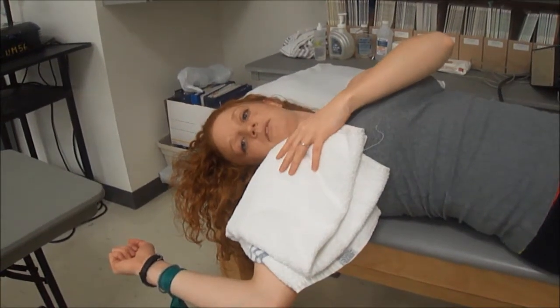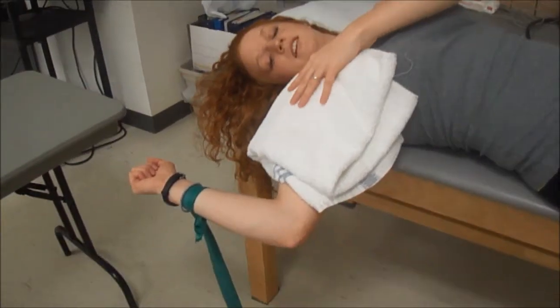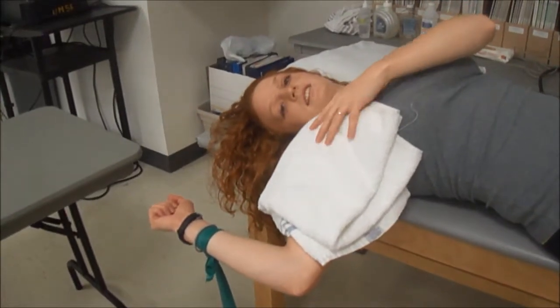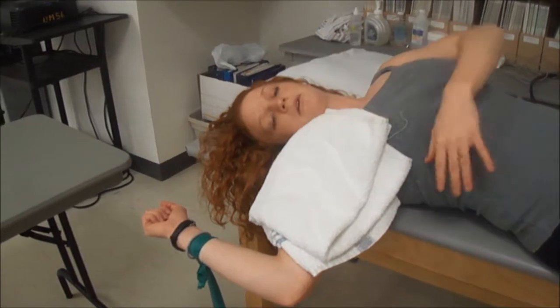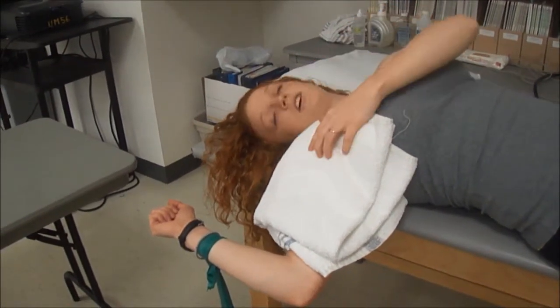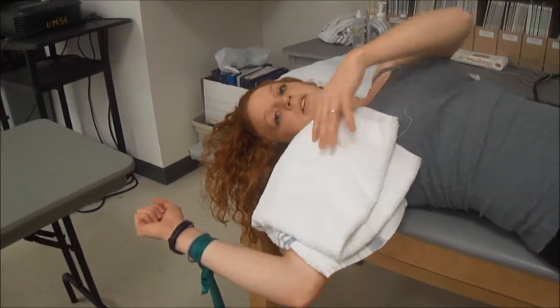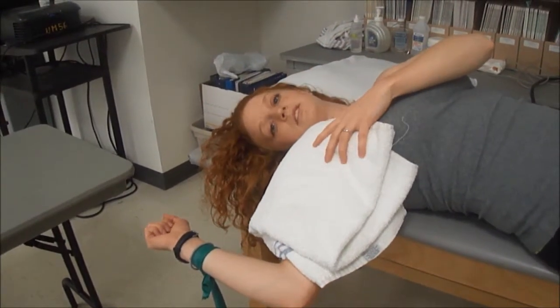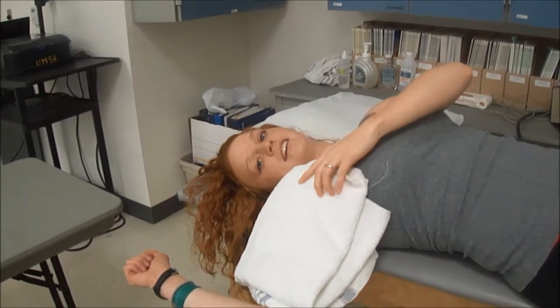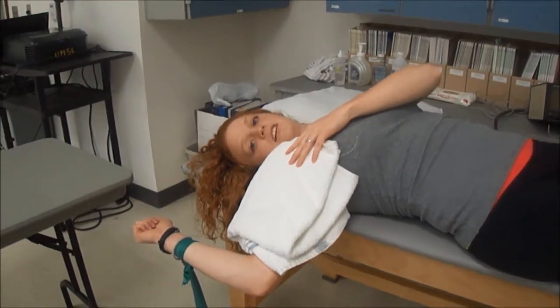To maintain the prolonged stretch, we would use a TheraBand tied to the wrist and then held to the ground with a weight, and this helps maintain that position so no one has to hold it. And if this was too much for the patient, they could loosen the TheraBand or place a pillow underneath their arm to reduce the range of motion. Superficial heat helps by increasing the plastic deformation of the collagen tissues.